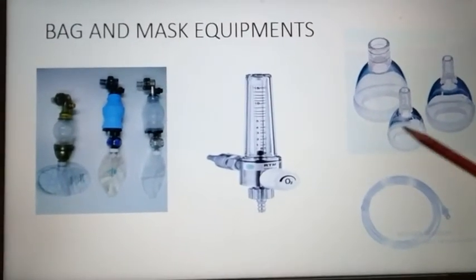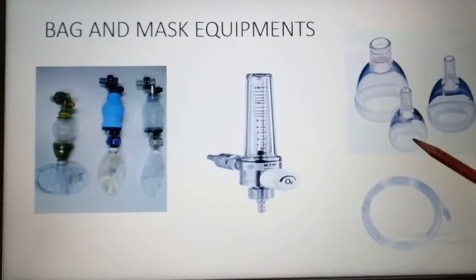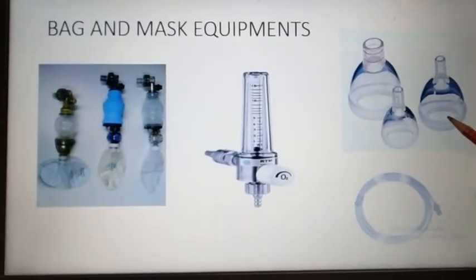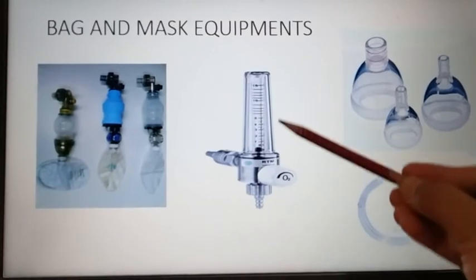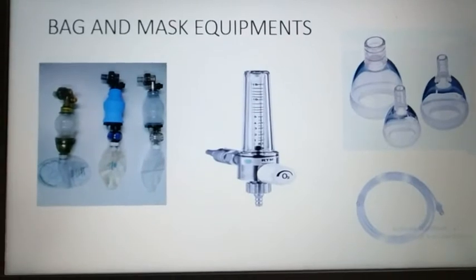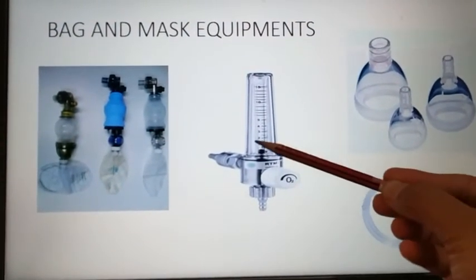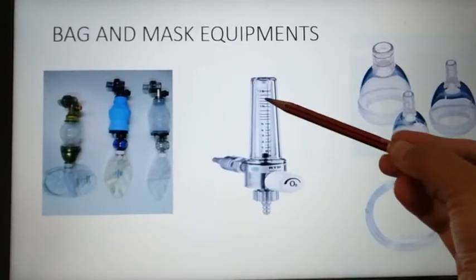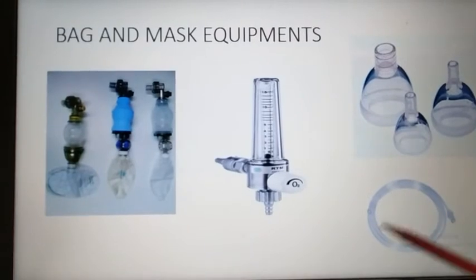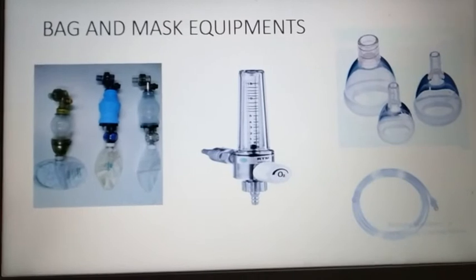This is an oxygen mask. For size zero, the oxygen mask is used in preterm neonates, and size one oxygen mask is used in term neonates. This is oxygen with a flow meter. You can see there are various markings indicating at what rate we have to provide oxygen. You can set the flow rate, and this is the tubing to connect with the flow meter and with the oxygen mask to supply oxygen.